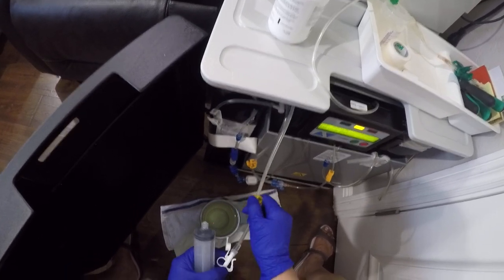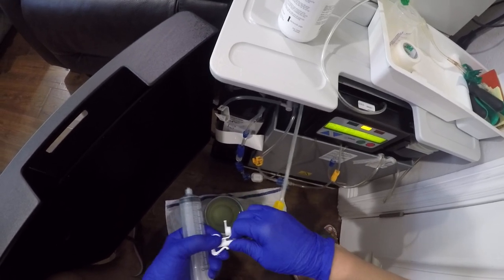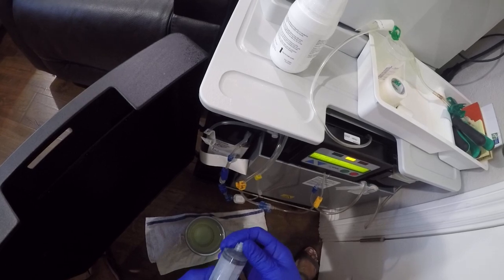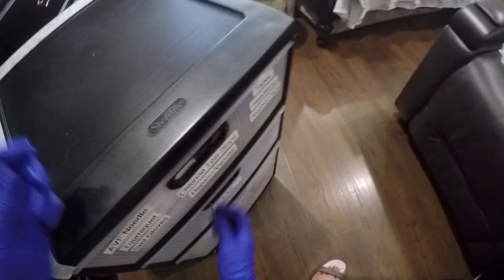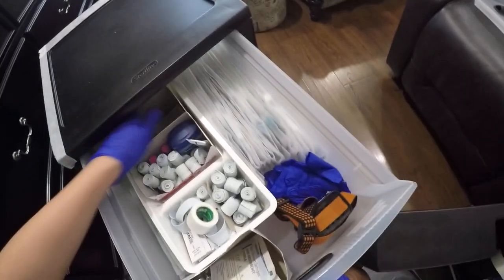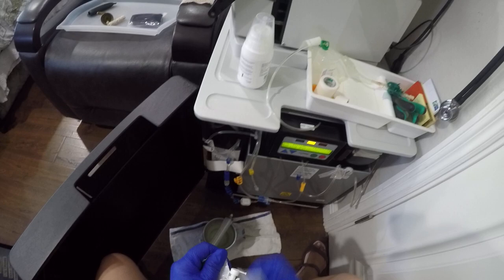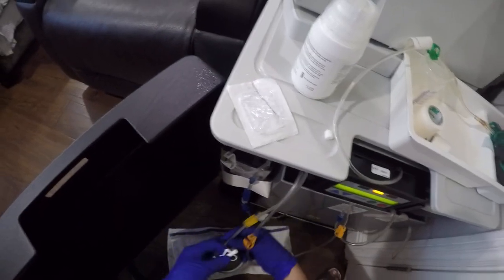If it leaks you'll have to replace Mr. Peanut. I replace Mr. Peanut maybe once a month — if there's a leak you have to replace it. They call this Mr. Peanut — why, I don't know.